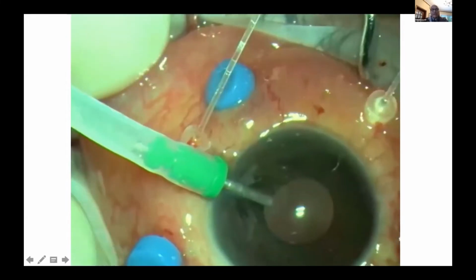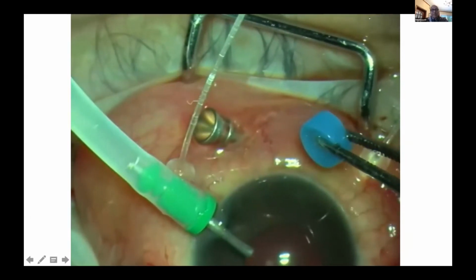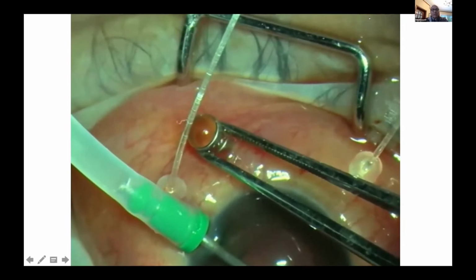I decided to do lensectomy at that point in order to avoid any anterior proliferation. And here I'm draining what is left of the choroidal detachment by elevating the trocar and moving the infusion into the anterior chamber. Here is the huge chorioretinal scar, and a lot of blood inside the eye. The infusion is back in place.